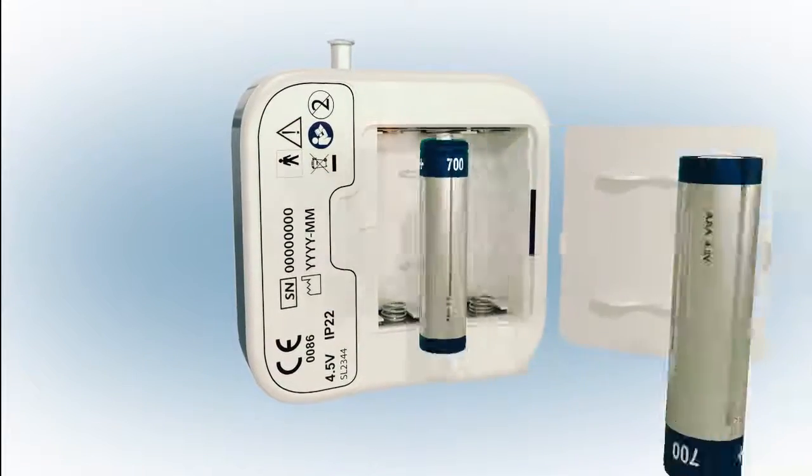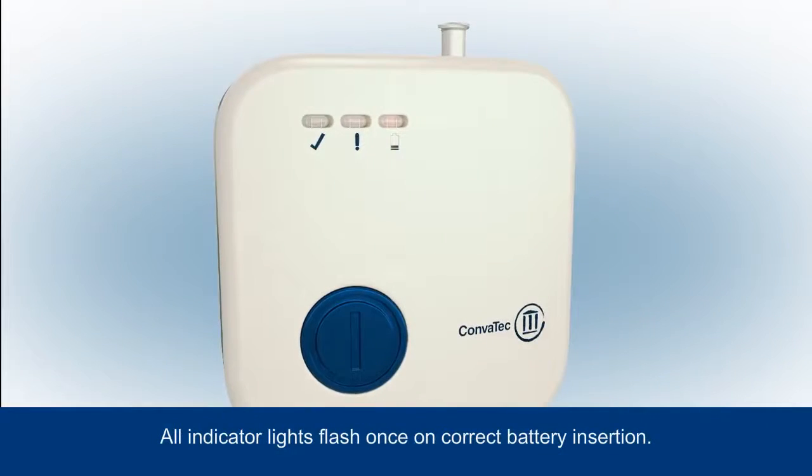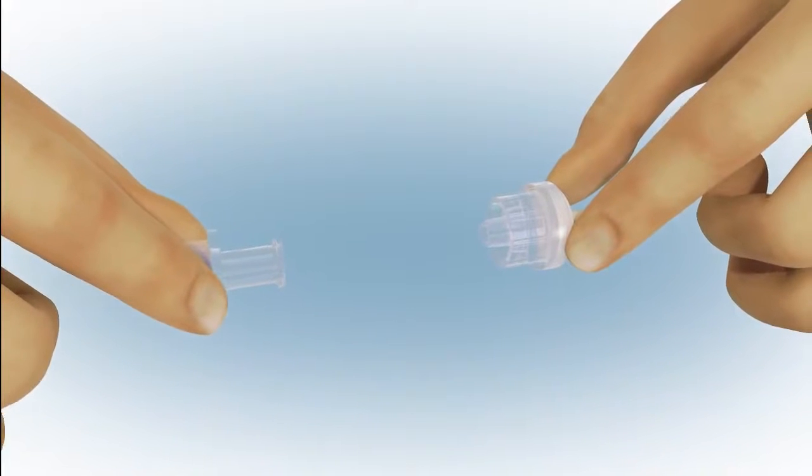Be sure not to trap the tubing. Place the batteries as indicated in the battery compartment — all indicator lights will flash once. Next, connect the dressing to the pump.